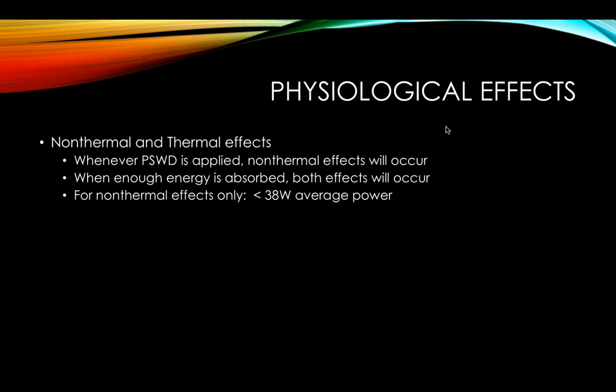We'll see in our next slides what all that non-thermal really does, but the non-thermal would be our typical, just like with ultrasound, right? Our indications would be acute trauma, post-surgical treatment, and then our thermal would be all of our indications that we had for even our superficial heat for thermal that go back a couple weeks now. So, we can really target those different areas as well.